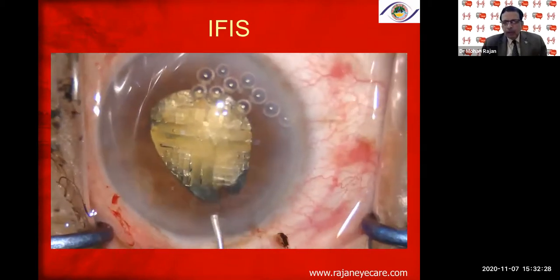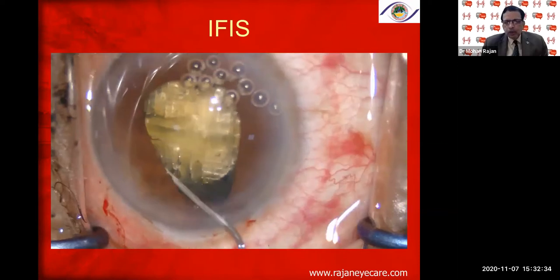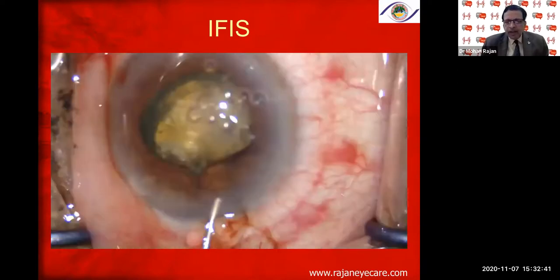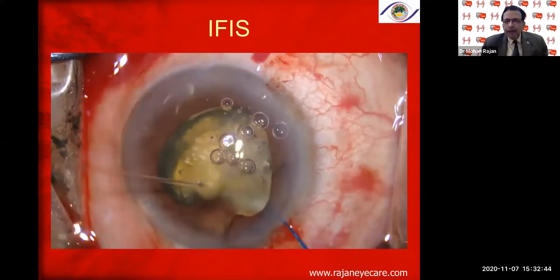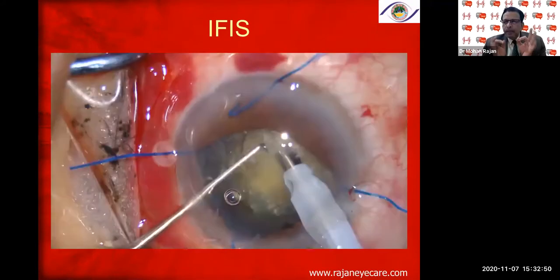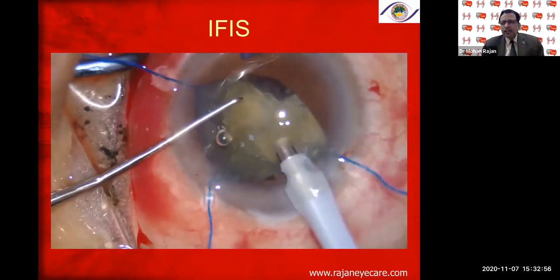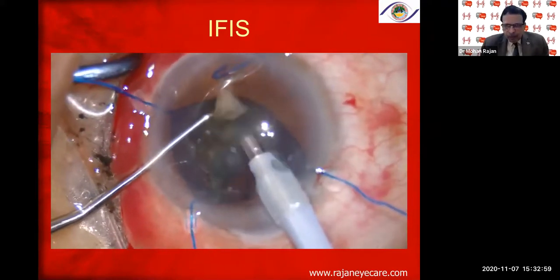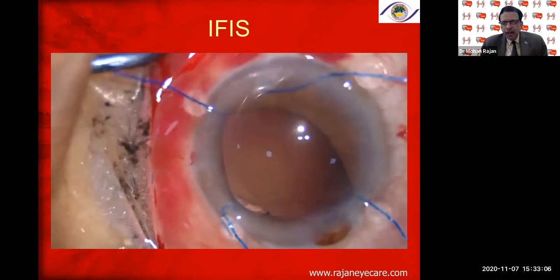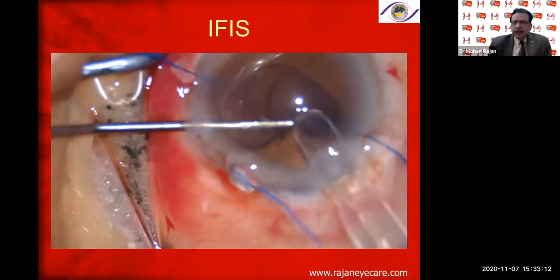I always inject a viscoelastic, like Viscoat, which I try to push the lens, or Healon GV is also very, very useful in this, because the heavy molecular weight pushes the nucleus. I use something like a shell technique, but you can see trying to push the iris back. But more importantly, in these patients, right in the beginning of the surgery use iris hooks. Very important, because this pupil is definitely going to come down on you. And once the pupil comes down on you during the surgery, it is going to give all the complications, like iris chafing, posterior capsule rupture, zonular dialysis, hydrodissection problems, bleeding from the iris, and all these problems can occur because of that.